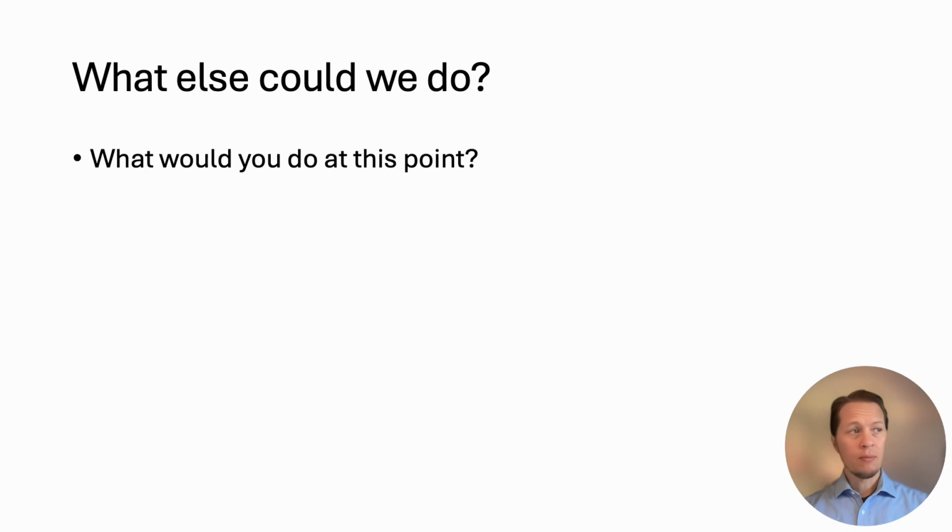So now what? We have some maybe soft findings, I'll give you that, but we have a patient that seems to have ulnar neuropathy symptoms. Is there anything else we would do? What would you do at this point? I chose one thing. There is still something that you can do, can be very useful in certain situations, and I'm trying to convince more and more electromyographers to do it.